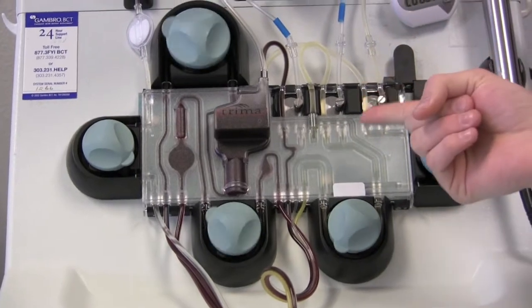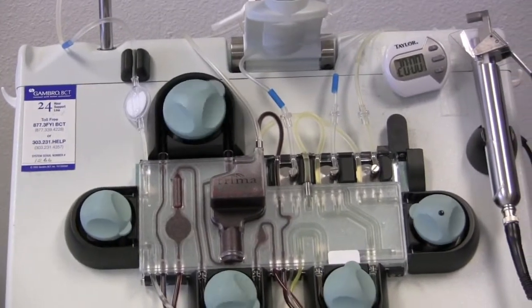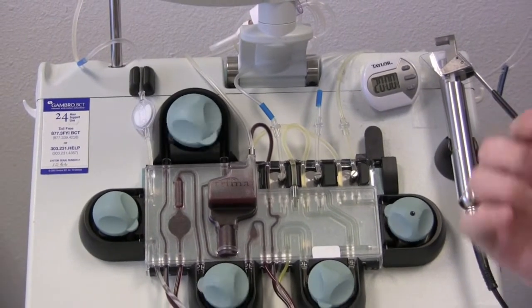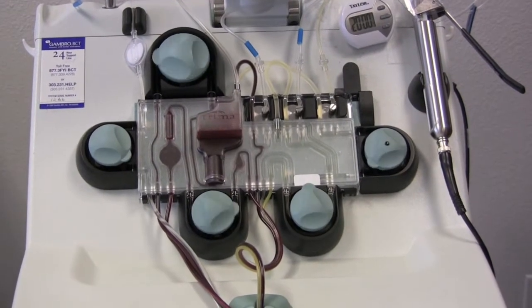So as the blood goes down, this is the blood that's coming right back into me, and that's getting mixed with the anticoagulant. So as the blood is centrifuged out and the platelets are taken out, it's put back in here until it gets back through the needle into my system.